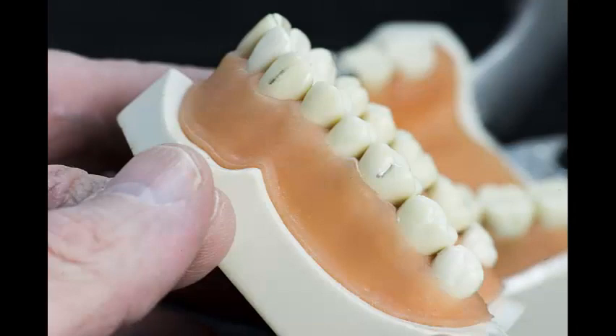I begin by marking the proposed bracket positions on the canines and first molars. I plan on placing brackets in the center of the clinical crown. These points are often called the facial axes. For the molars, brackets will be centered over the mesial buccal groove.